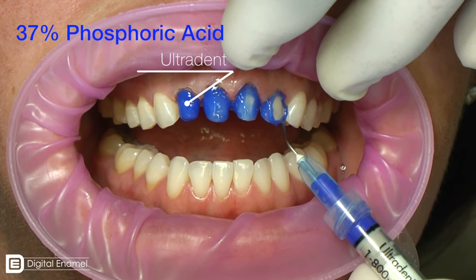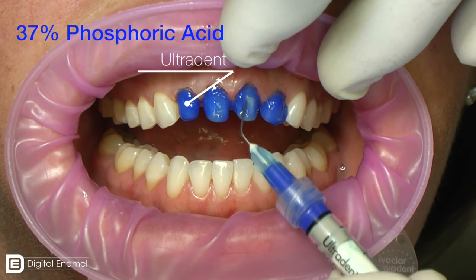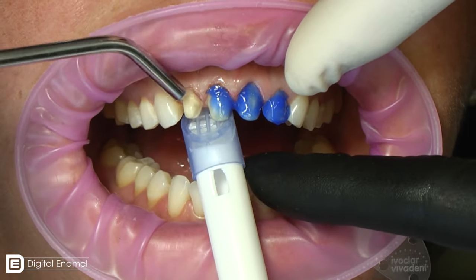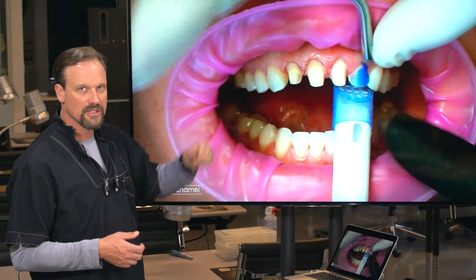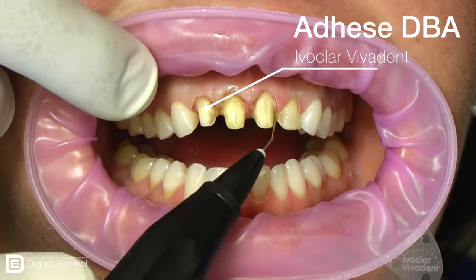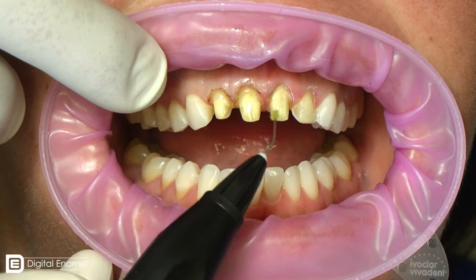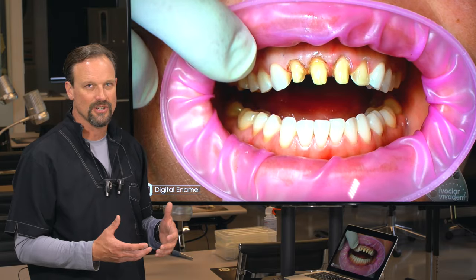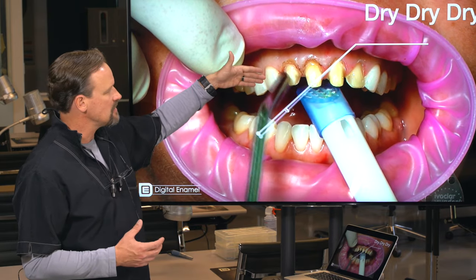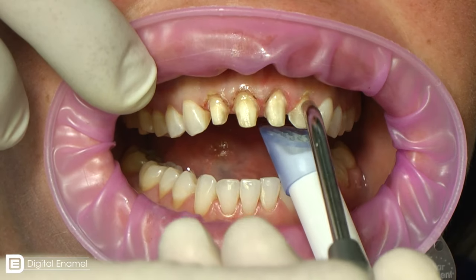We need to bond these in. I believe in etching — I love to etch and need to see the enamel etch. This is 37% phosphoric acid from Ultradent. We want to keep that on for the appropriate amount of time, then rinse it off really well. We used a little laser on her tissue, and you have to make sure you have crevicular fluid and any hemorrhaging controlled completely before you get to this step. I love the Adheese system from Ivoclar Vivadent — the delivery system is awesome, it has an organic etch in it, and everything needed for bonding. If phosphoric acid would induce hemorrhaging in an area, you don't have to use it — the Adheese organic etch will not induce bleeding.